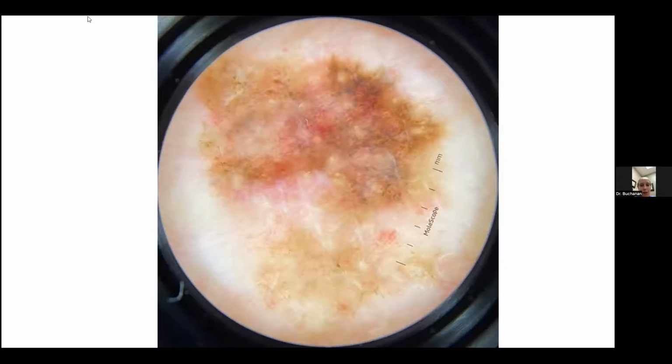So I think, possibly some white shiny lines toward the bottom there. So I think given the way it looked clinically and then with the dermoscopy features, you would probably want to make sure this wasn't a melanoma or possibly melanoma in situ. Excellent, absolutely.